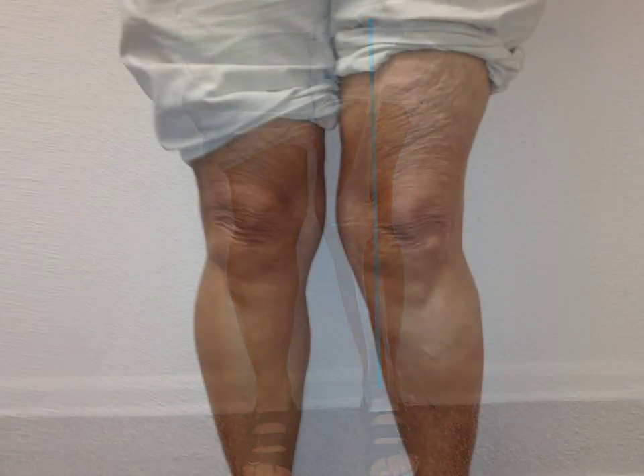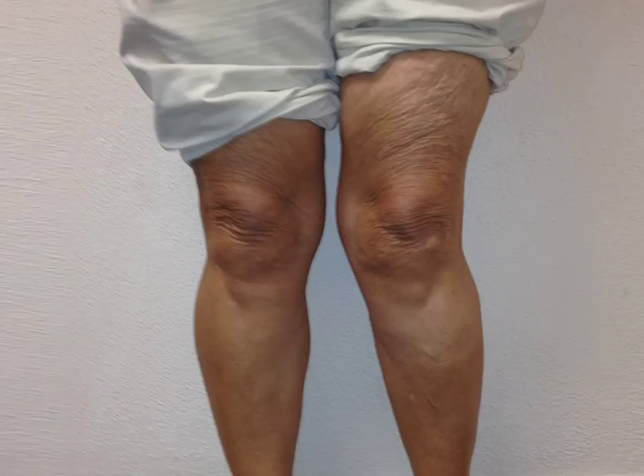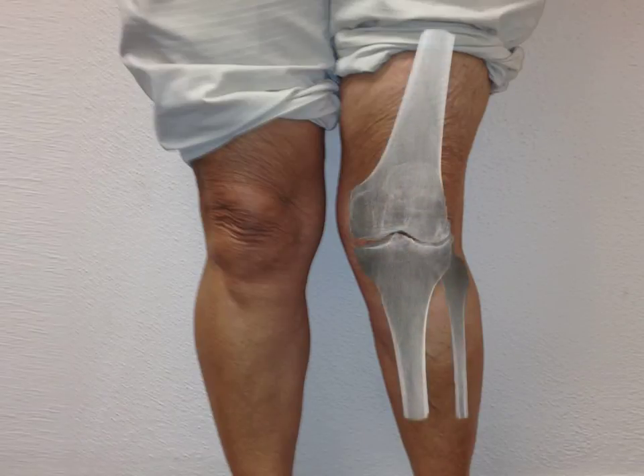Here is a closer look at Mary's knee before surgery. When I apply her x-ray on top of her leg, her arthritis starts to become more apparent. She has significant joint space narrowing on the outside of the knee, leading to her knock knee deformity.